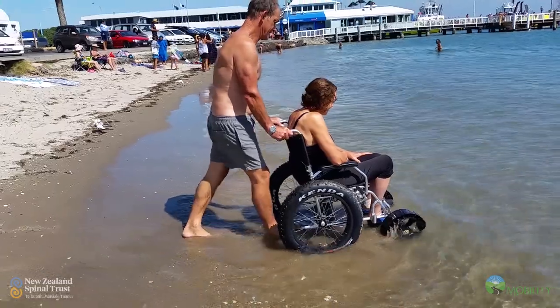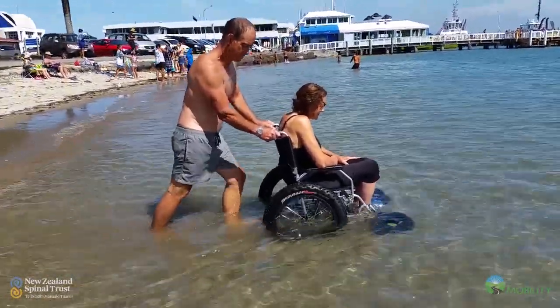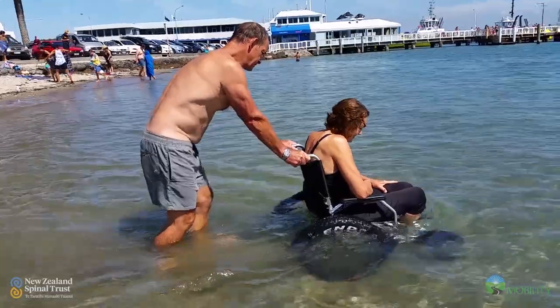So Frank came up with an idea that he would just build one. He bought a relatively cheap wheelchair online and adapted it. He took the big wheels off the back of the wheelchair and put the big fat wheels on it.